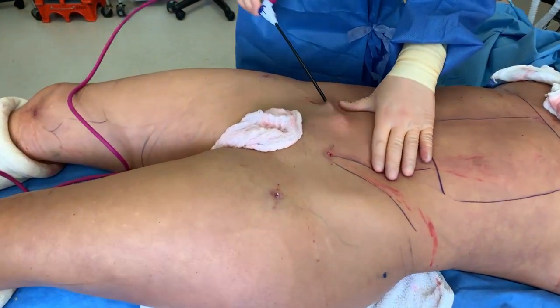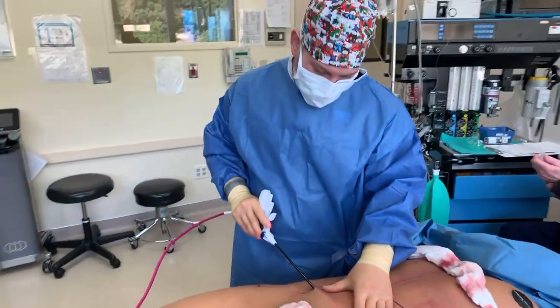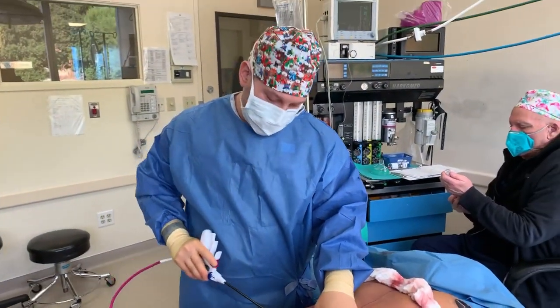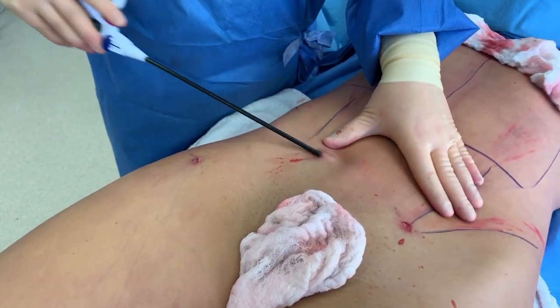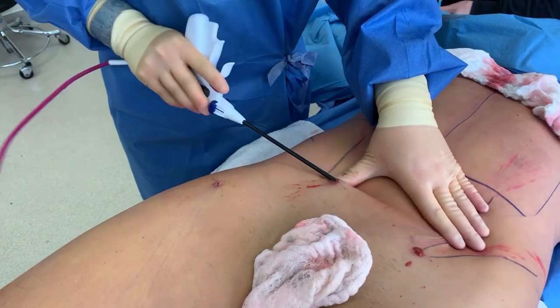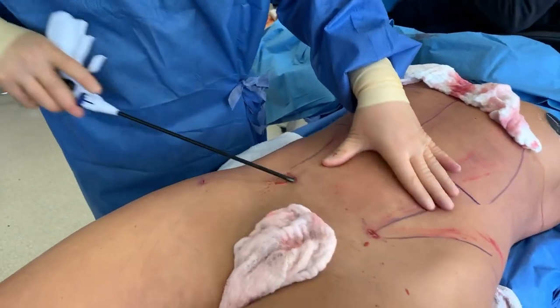The Renuvian internal plasma right now is contracting the tissue internally. Come on close and show them — listen to this, you guys. There's a huge amount of skin tightening going on underneath the skin. You can see smoke coming out of the quartz.